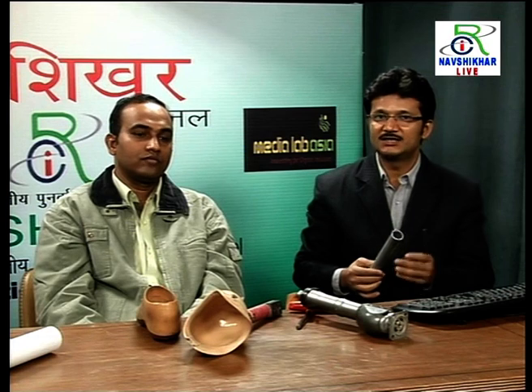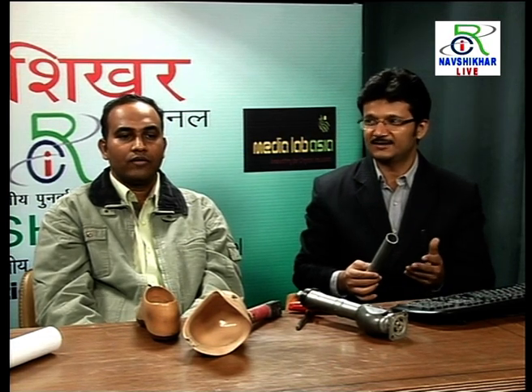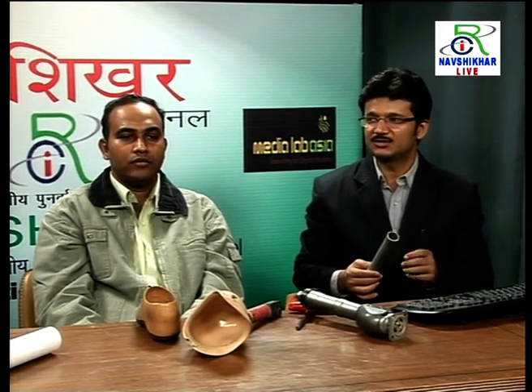Sometimes the patient has two or three types of feet, and according to his requirement, he changes his foot. If he is doing common household work, he uses a SACH foot. If he is going outside for work, he uses a dynamic foot. And if he is running or doing sprinting or a heavy duty job, then he uses a carbon fiber foot or flex foot. Such interchangeability is possible in the modular concept, and even this changing can be done by the patient himself.